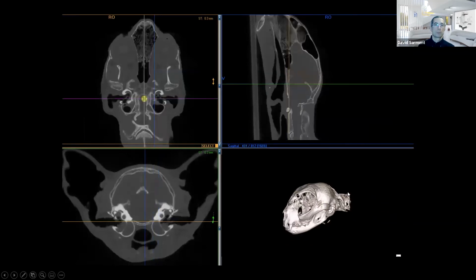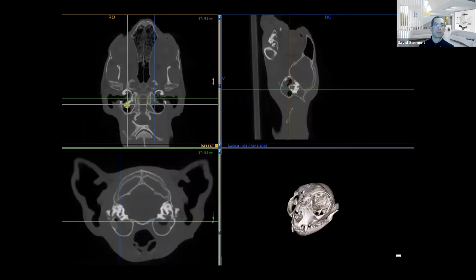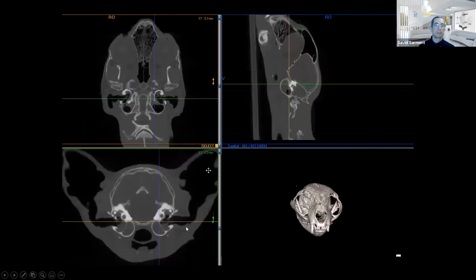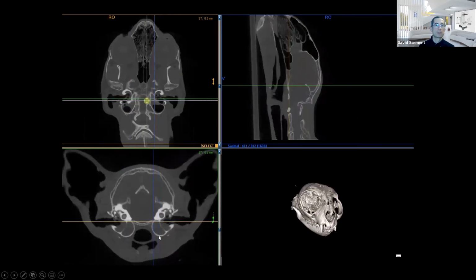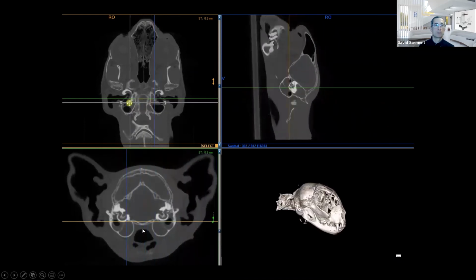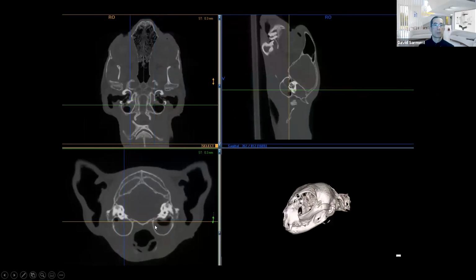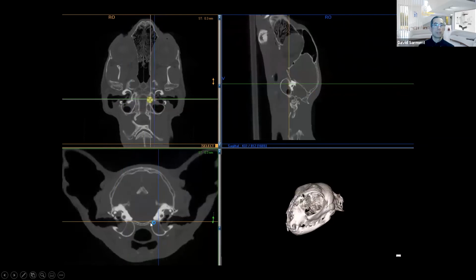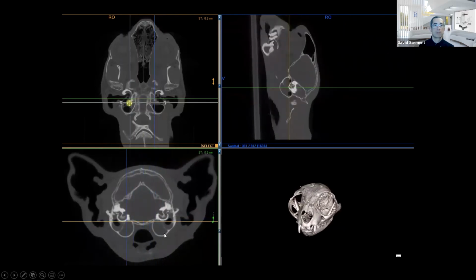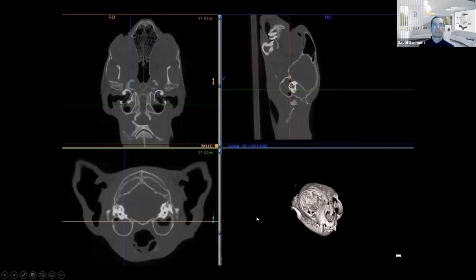And finally, here's just a quick video showing you the manipulation of this MPR view and how quickly you can travel. Here, focusing on ear disease in this cat. You could clearly see the details of the bulla and appreciate the pathology within the bulla. This is bilateral acute pathology. Why do we know it's acute? Because you have sort of a water level of this pathology, and you have preserved bulla walls that look intact. They're still very thin. They haven't thickened. So we can do a lot of diagnosis by looking at that image as well.